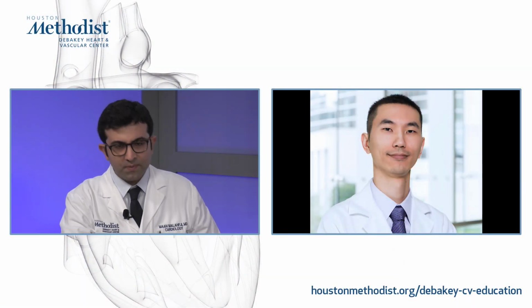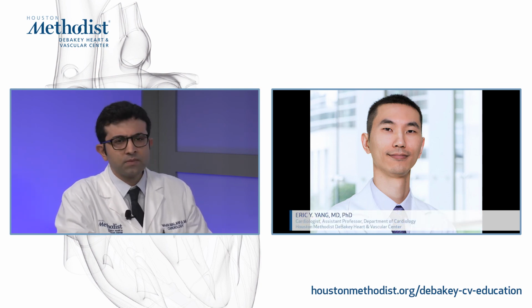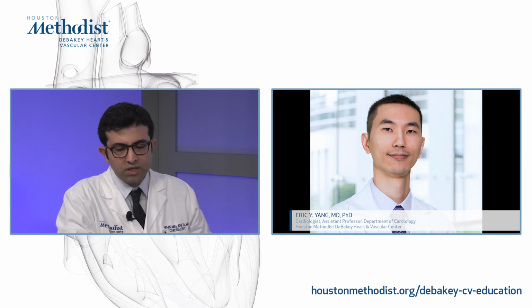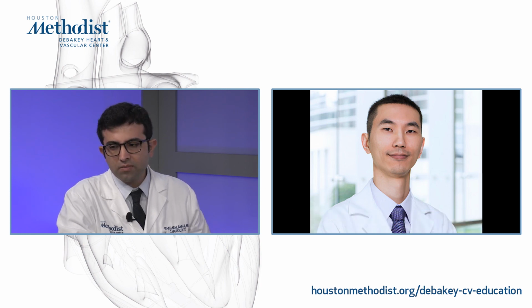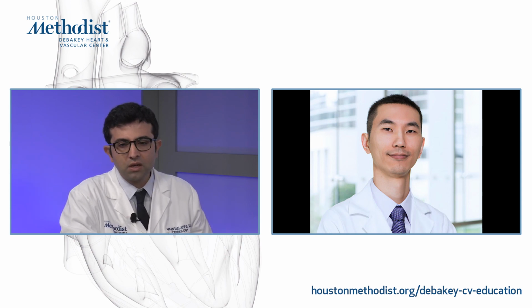Hey, Maan, this is Eric. Hey. So I saw that you showed that there are real-time single breath hold sequences. Any advances on the 3D CMR sequences? I saw a bit about that. I didn't really include it here. I don't know of any commercial software that's doing it. Unfortunately, a lot of these studies are done on software developed in-house or some proprietary software that's not available to us. So before it's something that's available commercially, it's hard to say. It will be very nice.